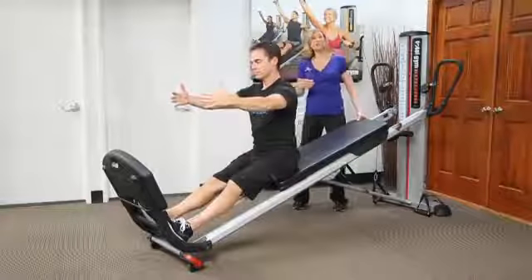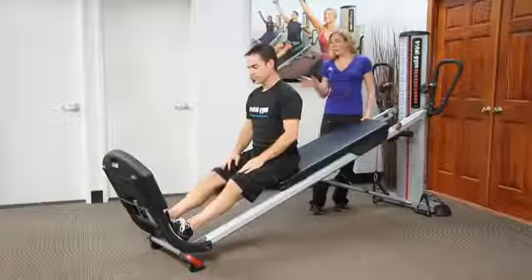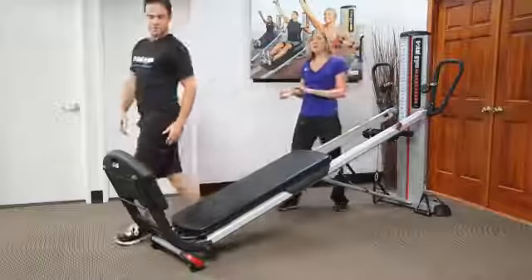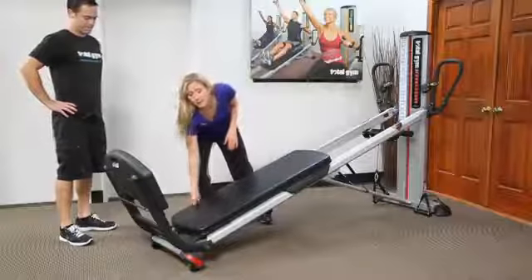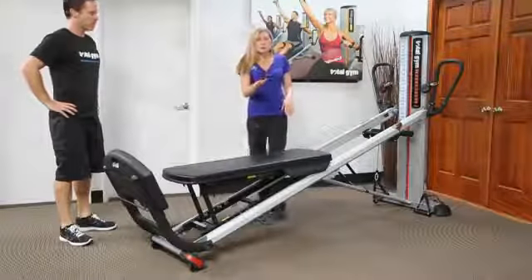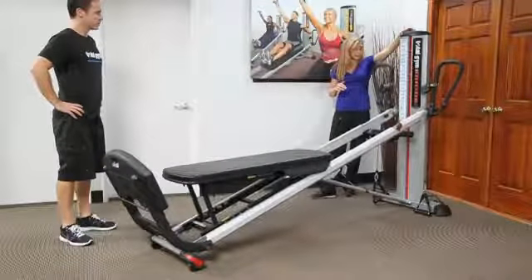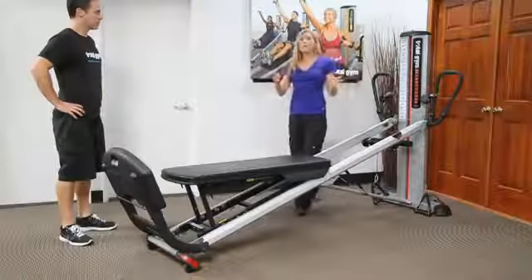Another exercise that actually becomes easier the higher the incline level is planks. I'm going to have Jeff straddle and slowly transition off the glide board. You can do planks facing the tower, but I also like doing planks with the glide board all the way up. When it's at about incline 13, the board is about horizontal to the ground. I'm going to decrease the incline, making the board level, and now he can go into planking.